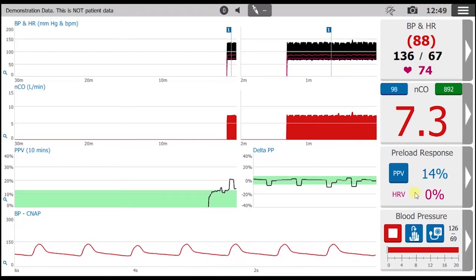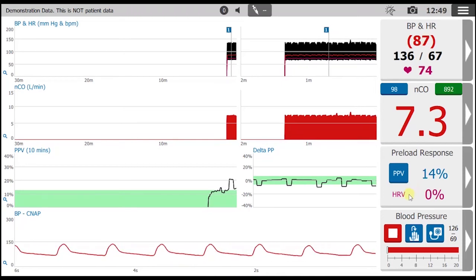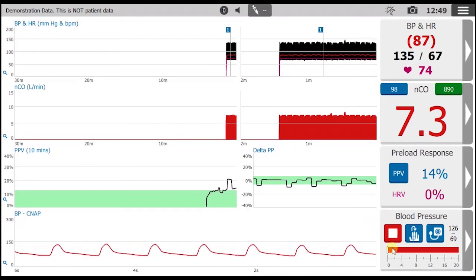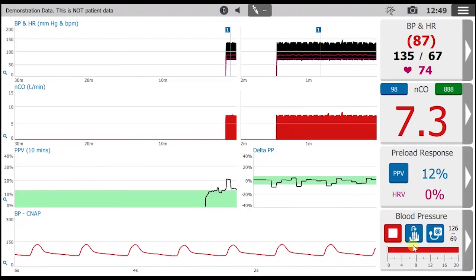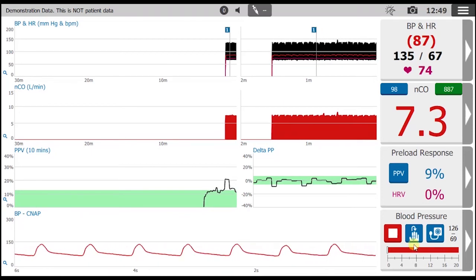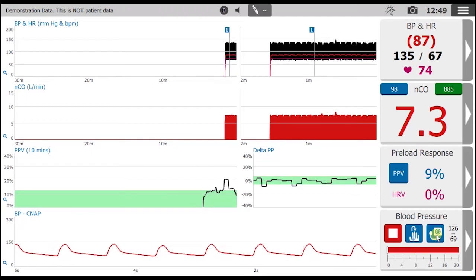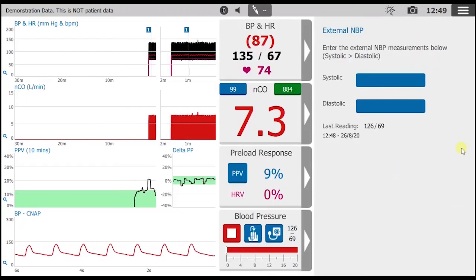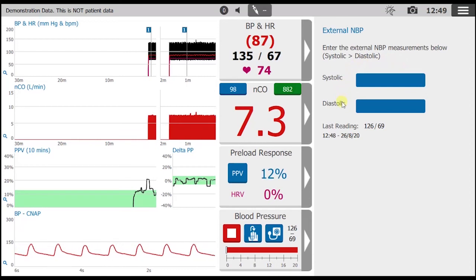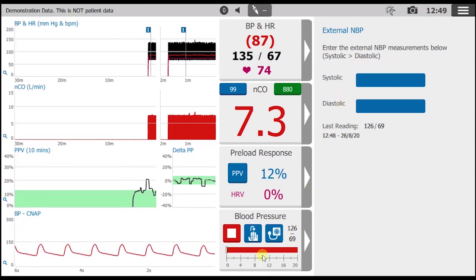The controls for non-invasive monitoring in the fourth channel include the red square to stop and deflate, a hand with an arrow pointing to manually change the finger being measured, and by entering new values from the brachial cuff, the scaling process can be repeated at any time. The bar at the bottom details the finger change interval.